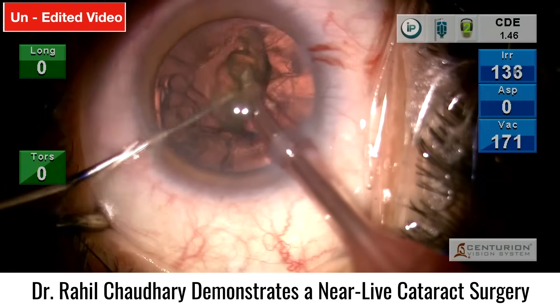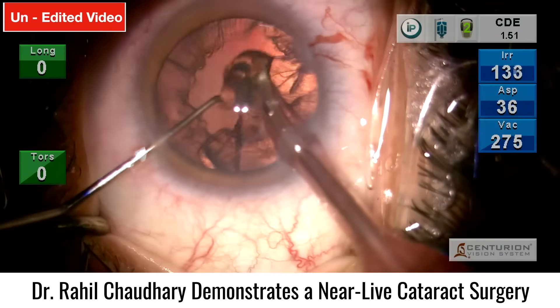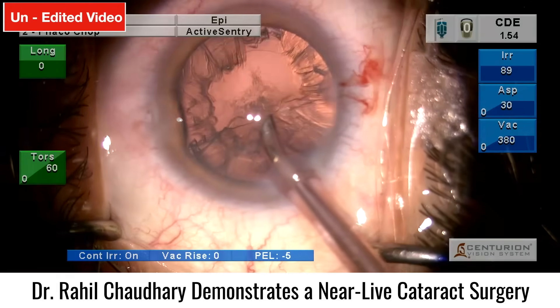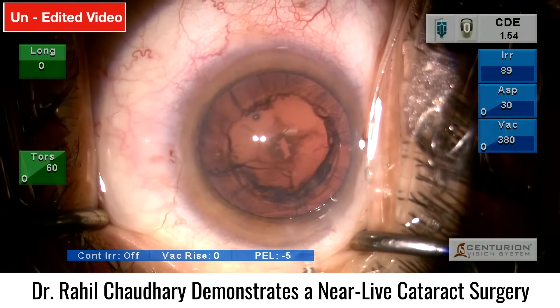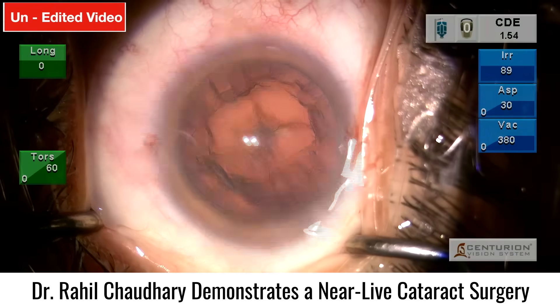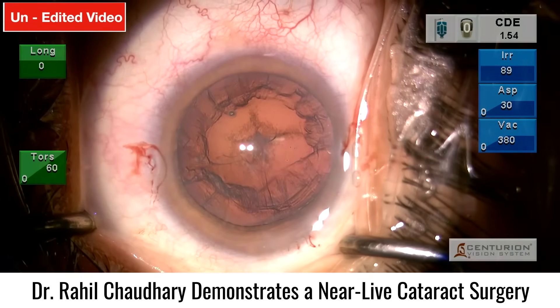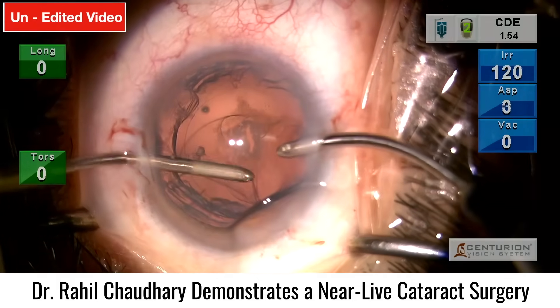The last quadrant is now emulsified nicely and perfectly. As we proceed with the implantation of the lens, I'll highlight more features of the PureC lens. When shifting to the EDOF platform, it can never be 100% glare-free. So when counseling my patients, I pre-counsel them about some reduced nighttime glare — I never claim it will be 100% glare-free like a monofocal lens.